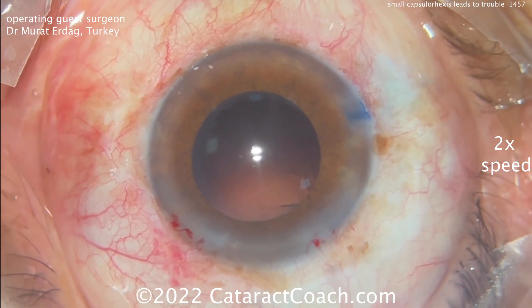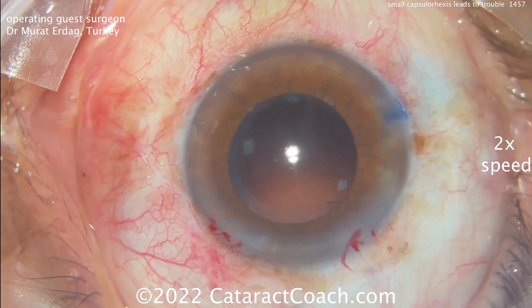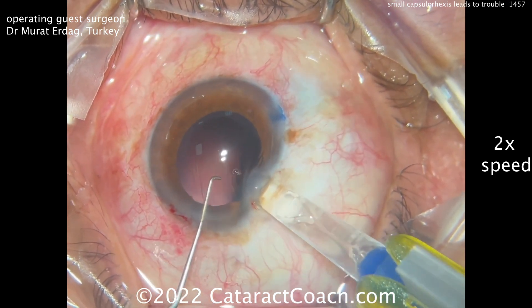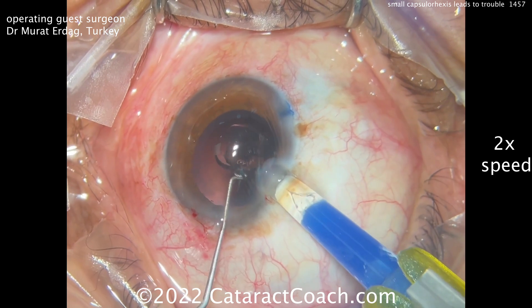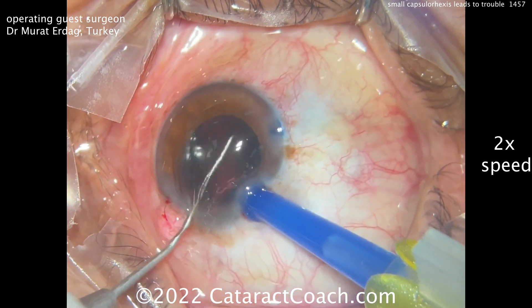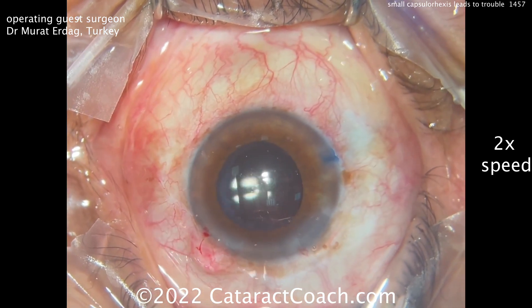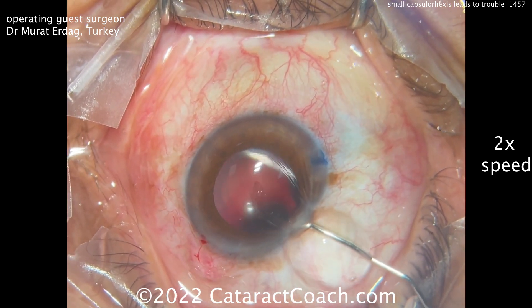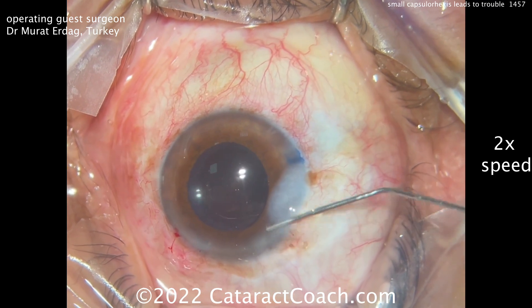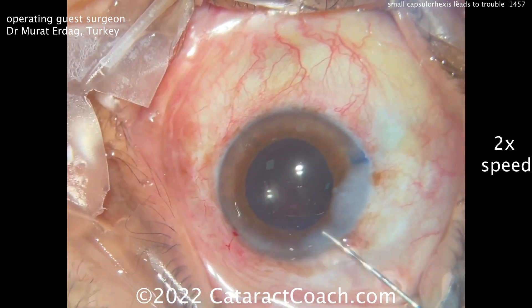When filling the eye with viscoelastic, do not overfill it. Fill it completely but don't overpressurize it, because that may cause the weakened capsule edge to zip back toward the posterior capsule. When placing the IOL in the bag, be gentle and super cautious — minimal manipulation and minimal rotation. If you can, position the haptics about 90 degrees away from the area of runout; here they're maybe 30–45 degrees away. They're removing viscoelastic by pressing down on the incision and sealing it up ahead of time before fully removing the viscoelastic.